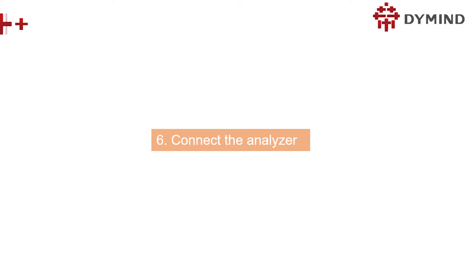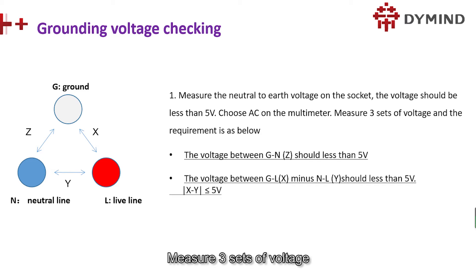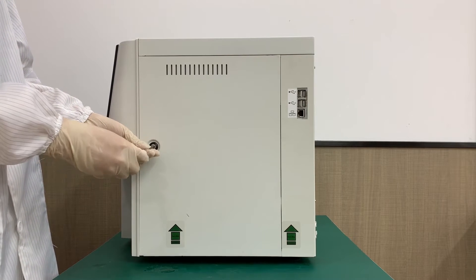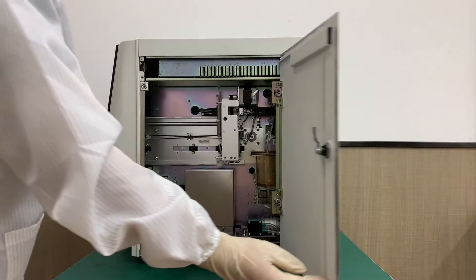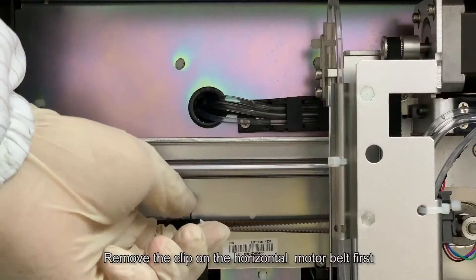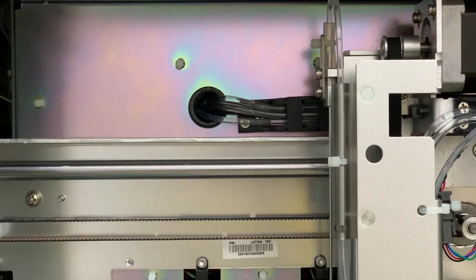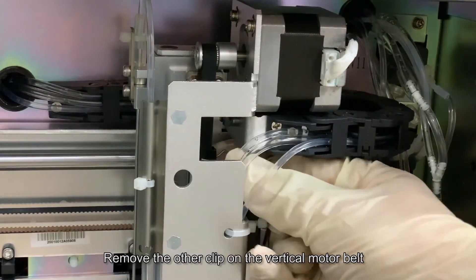Next we are going to connect the analyzer. Measure the neutral to earth voltage on the socket — the voltage should be less than 5 volts. Measure three sets of voltage; this is the voltage requirement. Open the right door. Remove the clip on the horizontal motor belt first, then remove the other clip on the vertical motor belt.